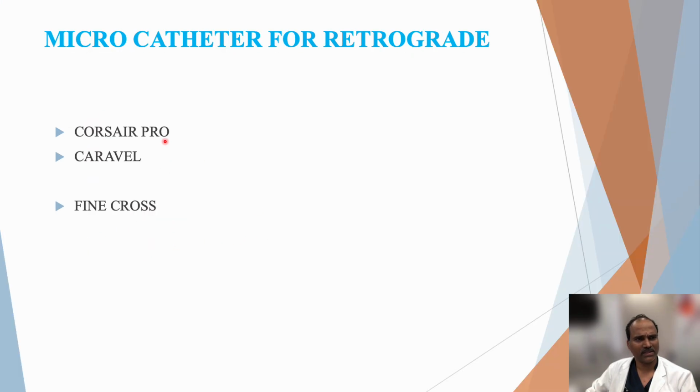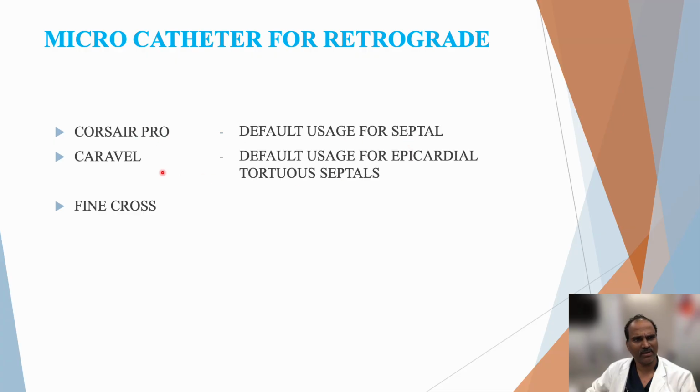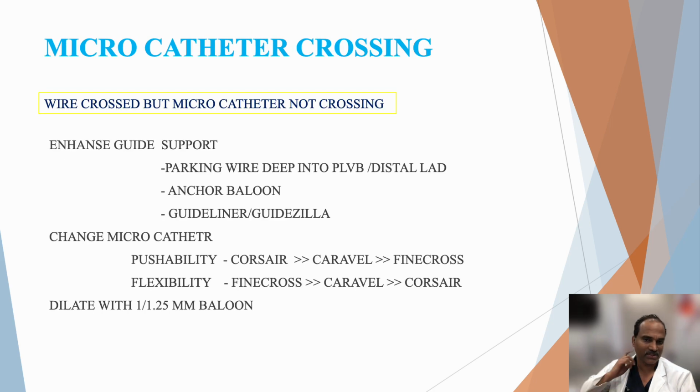Coming to microcatheters, my default microcatheter is Corsair Pro for septals, and Caravel for epicardial collaterals and also tortuous septals. I use Caravel, and Fine Cross wherever these two are not working. I switch to Fine Cross.